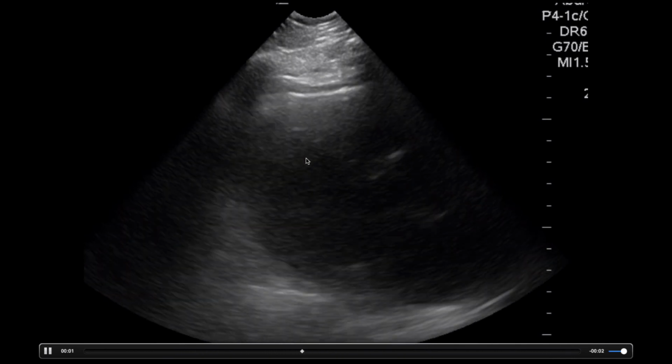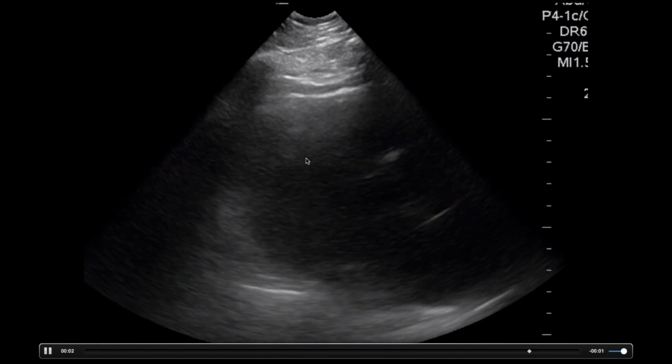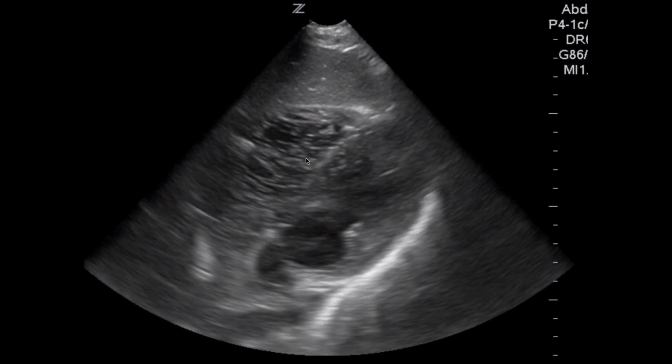This is a patient that actually had ventricular tachycardia, so not VFib, but still a shockable rhythm we need to get the patient out of. And I hope you're seeing that ultrasound can be very sensitive to identify these arrhythmias.